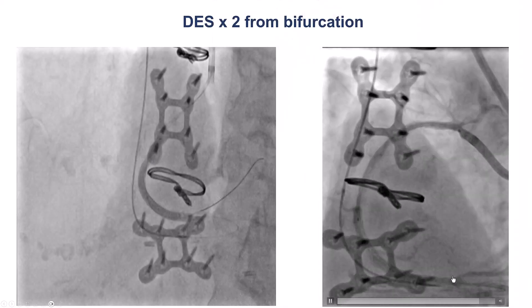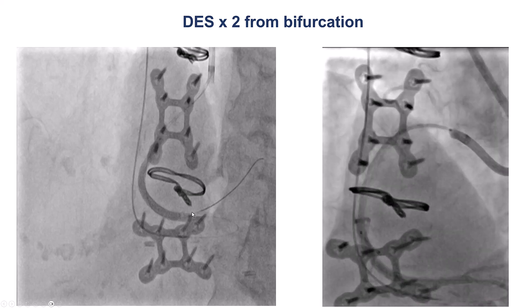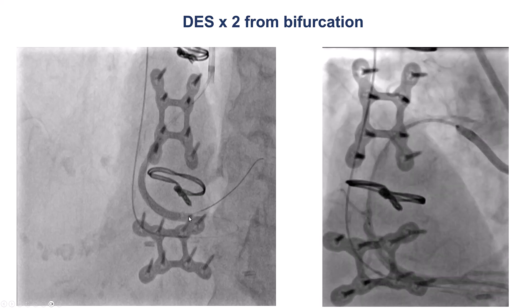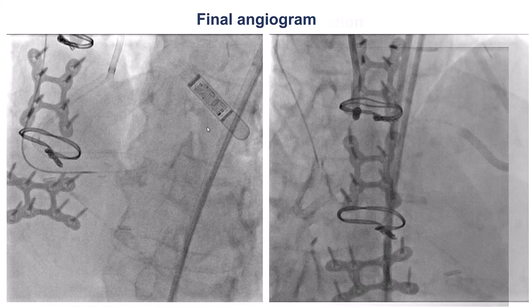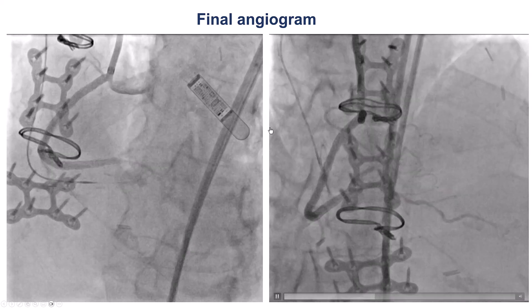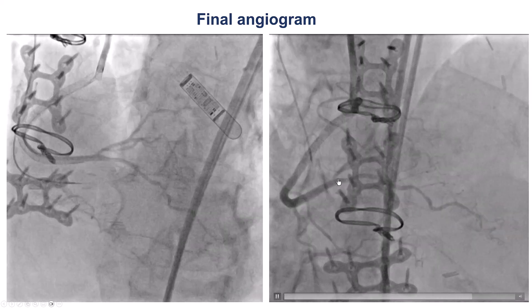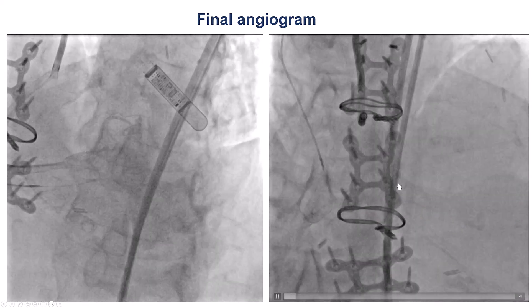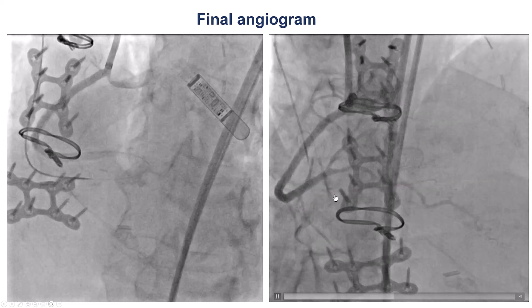We then stented all the way from the distal RCA to the proximal right coronary artery, and this provided a nice result. We had excellent flow in both the PDA and the right posterolateral.